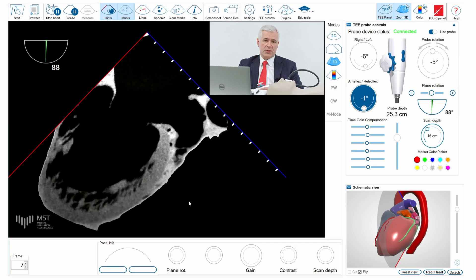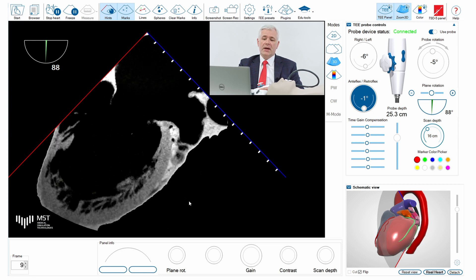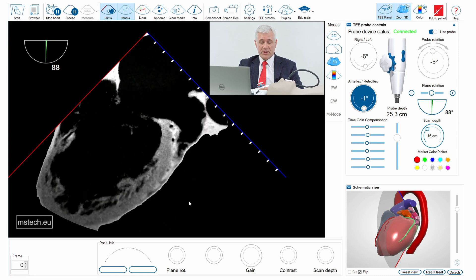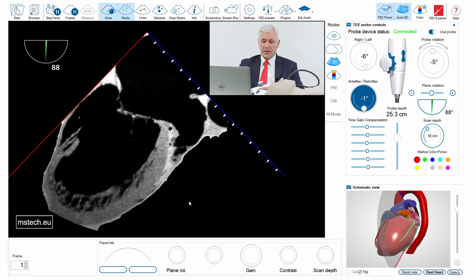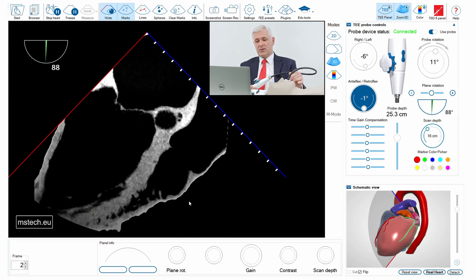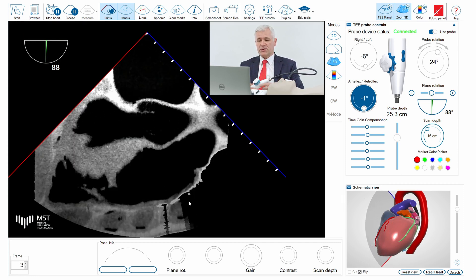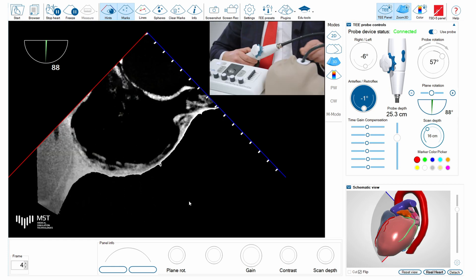Transseptal puncture is a crucial element of many structural heart interventions on the left heart, and it's a relatively difficult procedure if you don't understand the anatomy well and don't know which part of the septum should be punctured in the individual case and individual procedure. Let's have a look at how we can train it in the Mr. Timothy simulator.